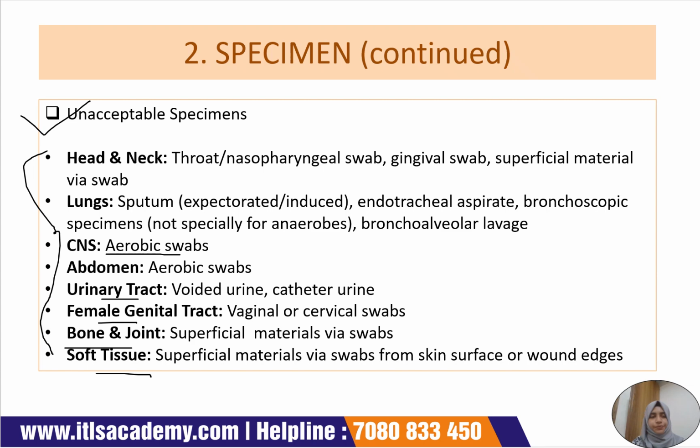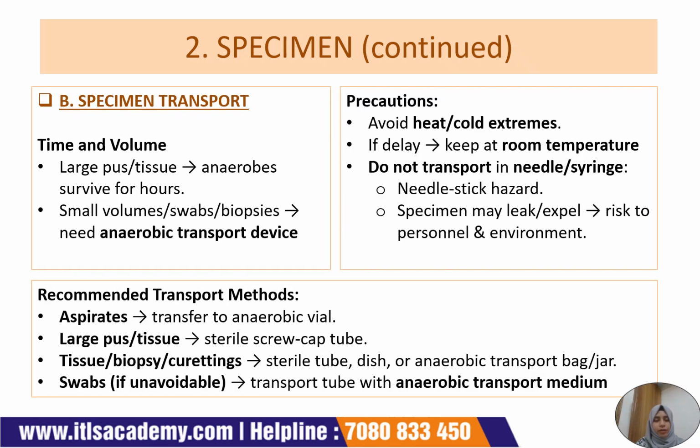All right, so let's start with our next subheading: specimen transport. First of all, what does specimen transport involve? Time and volume. Why time and volume? Because transport time depends on the volume and nature of the specimen.